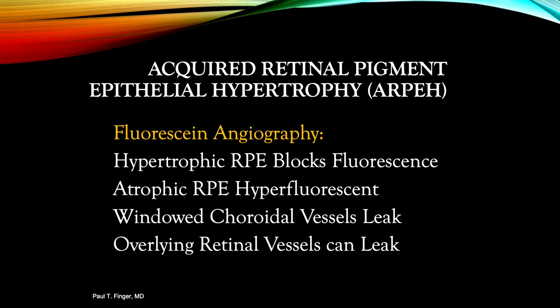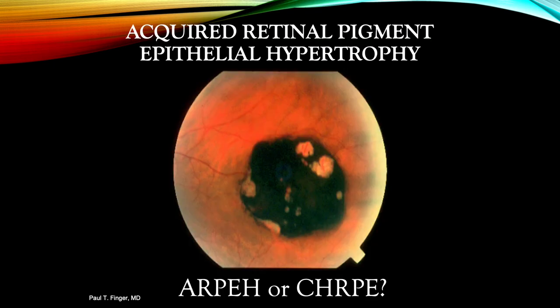The perfect example of this phenomenon is retinal pigment epithelial hypertrophy. Since the RPE is thickened, these lesions appear as blackouts on fluorescein angiography. Conversely, when there are islands of RPE atrophy, imaging reveals the underlying choroidal circulation. I often hear doctors present this lesion as CHIRPY or congenital hypertrophy of the retinal pigment epithelium — but was it present at birth? No. Real CHIRPY looks like bear tracks, as seen later in this tutorial.